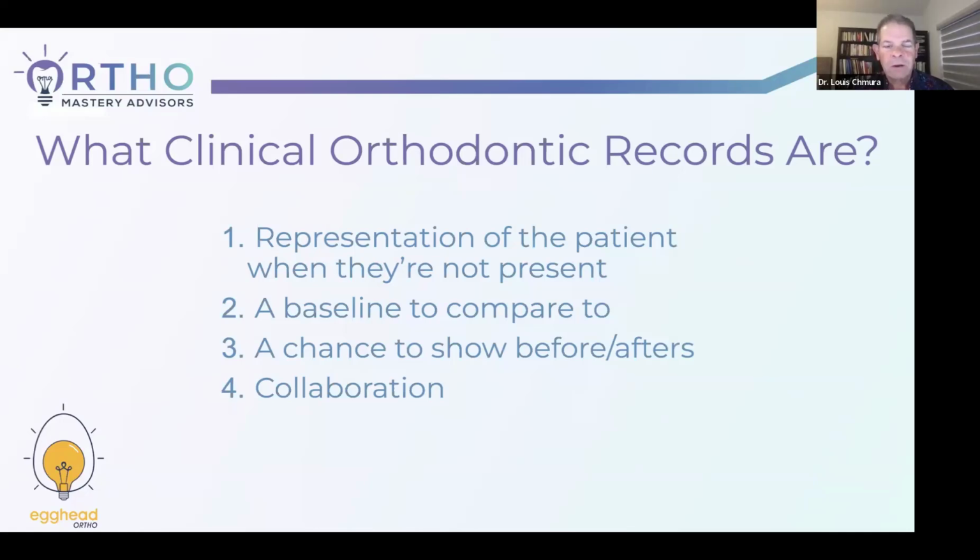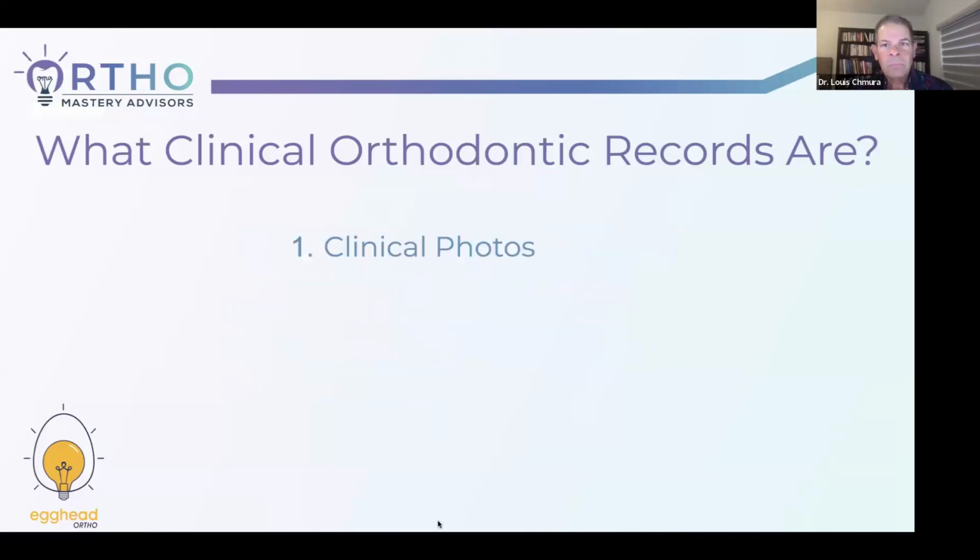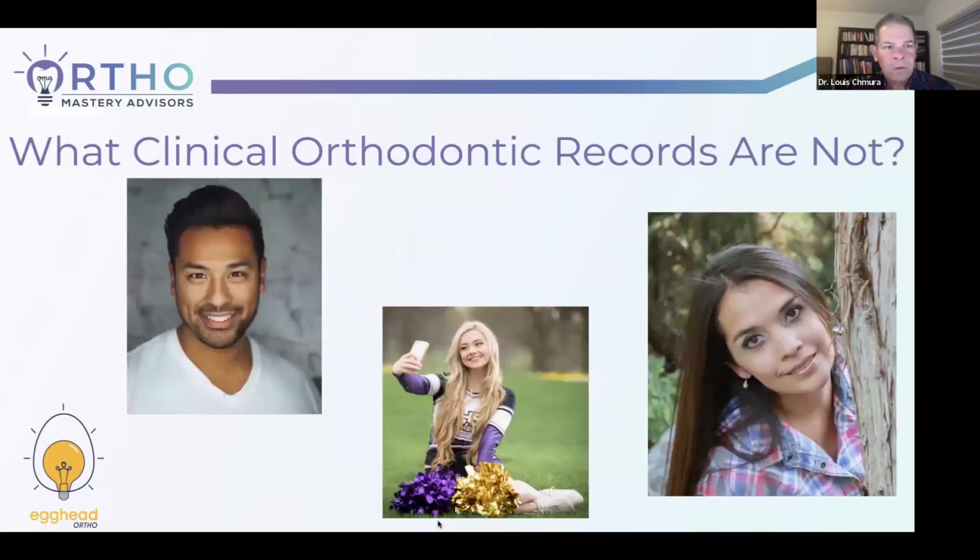If you have good records, you can share those, and you can do this from just about anywhere. As I said, clinical photos, radiographs, and the intraoral scan. And the intraoral scan is critical because often now you can order appliances, not just aligners, but other appliances from the intraoral scan.